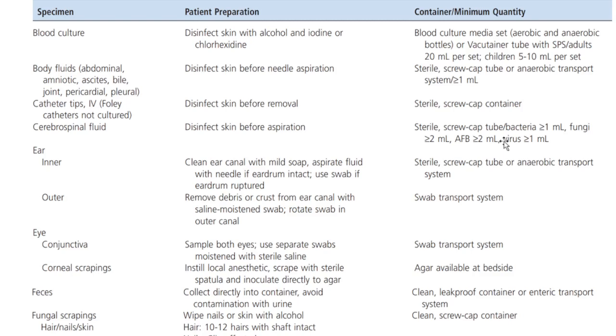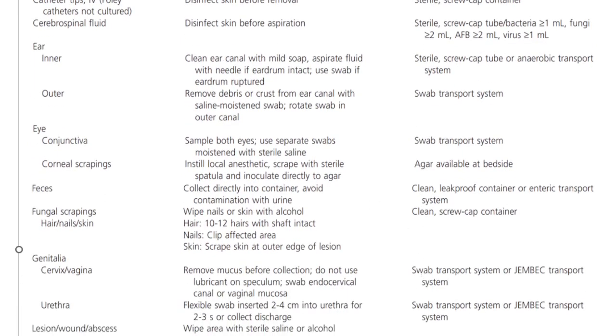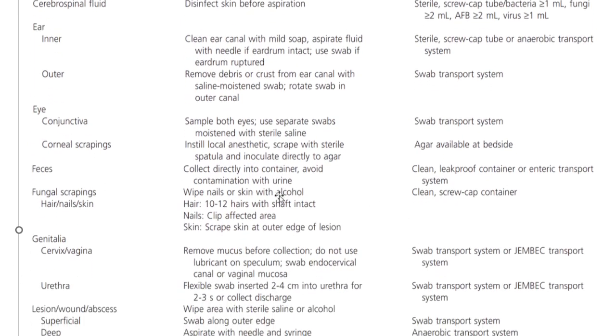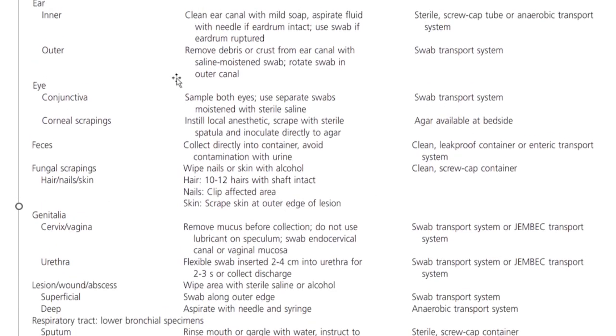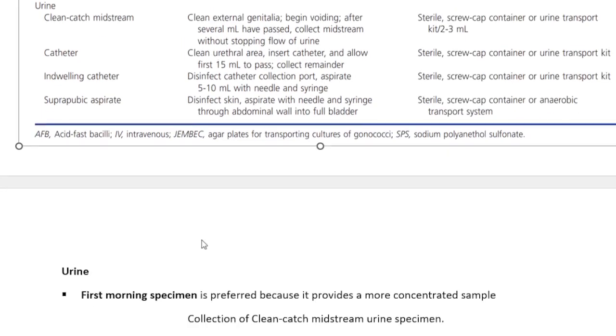Okay? So, you clean the ear canal for the ear, or remove debris from the outer ear. Use a swab transport system or anaerobic transport system. So, familiarize yourselves, guys, with these collection guidelines. We will not discuss this in detail because it's already here. These are guidelines, so they are not discussed further. What you see there is it. They are not modified based on what you want as medical technologists.